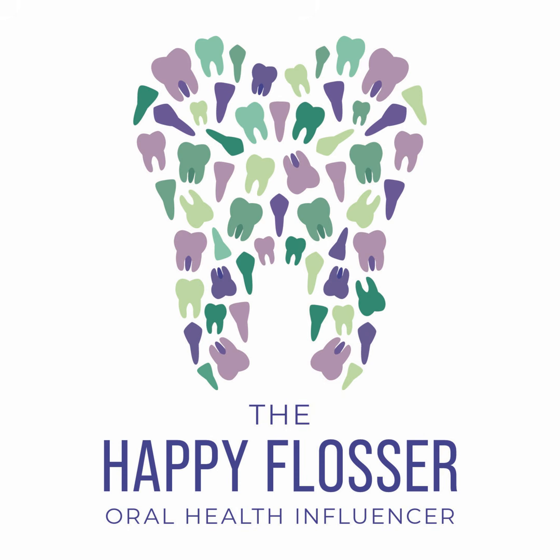Opacity, an opaque lesion. Something I think of that's totally benign, that shows up on radiographs with an opaque appearance, would be mandibular tori. Mandibular tori are really, really large and they show up as opaque. And boy, do they make taking radiographs very challenging. So that would be an example, and that would be a completely innocent thing to see show up on a radiograph. So thinking about location and appearance, and then when you look clinically, that will help you determine whether or not this is something to be concerned about, or is it a variant of normal?